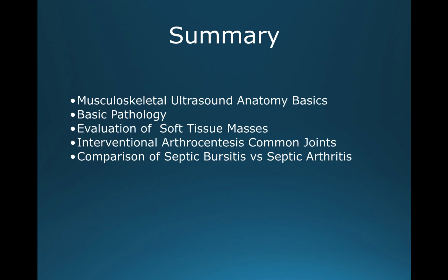I think the best way to get better at interventional arthrocentesis of some of these joints is practice. I will do a lot of musculoskeletal ultrasound in my practice to look for joint effusions. I will do a lot of musculoskeletal ultrasound to look at the patella tendon and quad tendon for quad and patella tendon tears. These are things that are very common that present to the ED as well.